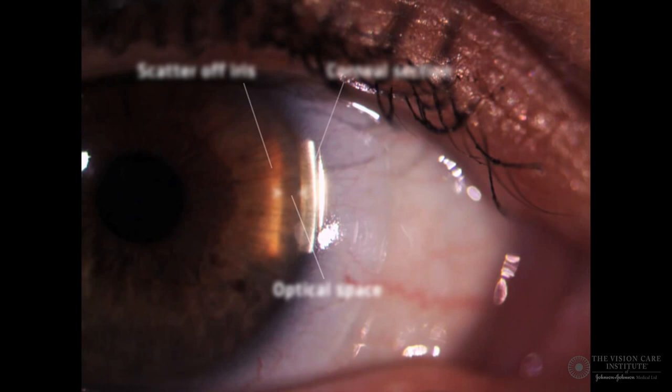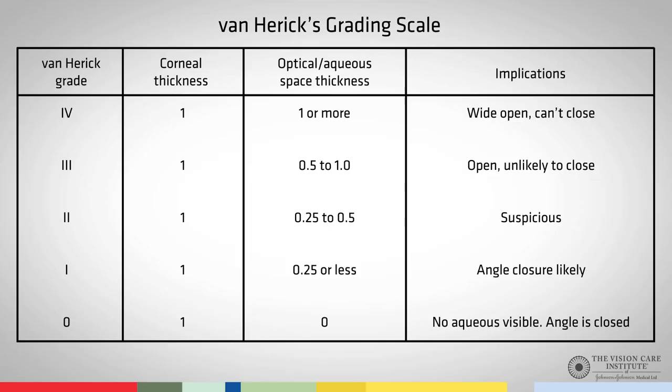Once we have this, we conduct the same assessment as we did previously, whereby the space between the endothelial part of the corneal section and the scatter off the iris is assessed. Then, just as with the temporal angle, we refer to the Van Herick grading scale.